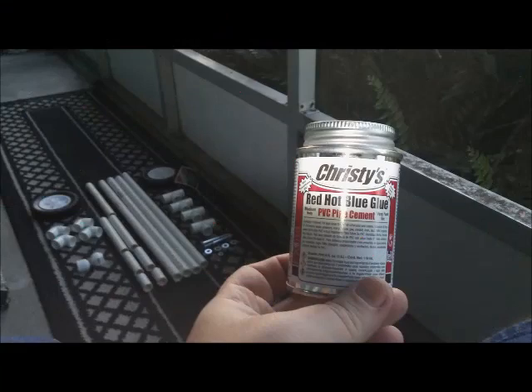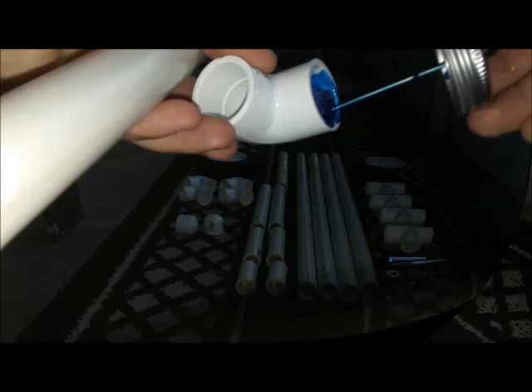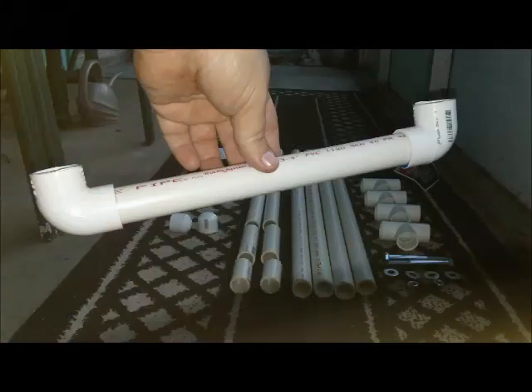I used red hot blue PVC glue for this project. Start off by taking a number four elbow connector and putting some glue inside one end, then take a number one body width piece and insert it into that. Then repeat that with another number four elbow.